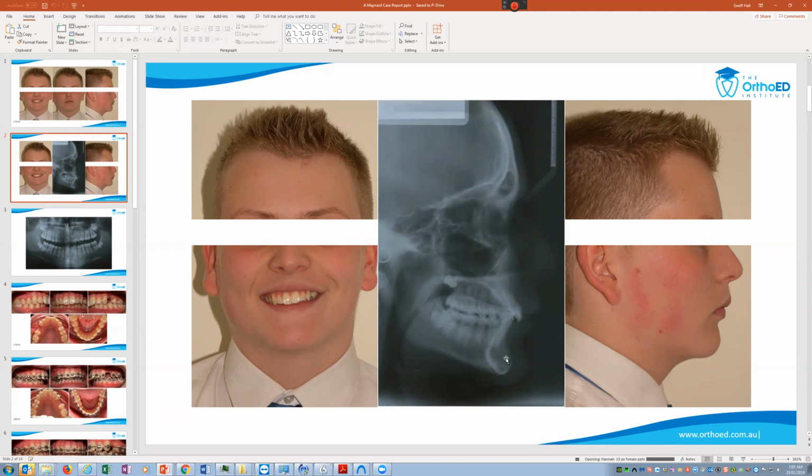Some of it's soft tissue contour and things, but also posture. Exactly. The problem is you've got a radiographer taking the X-ray normally, so you don't know whether he's been postured forwards or not, but you've got to look at the amount of overjet here compared to the amount of overjet in his clinical photos, which I'm going to show you in the next slide. But it could just be a deficiency in the hard tissue of the chin. To me, he looks a lot more retrognathic in the photograph than he does in the lateral Ceph. Yeah. And in the Cephs, a lot of the time they get the kids to tip their heads up rather than adjust the machine. That's exactly right.